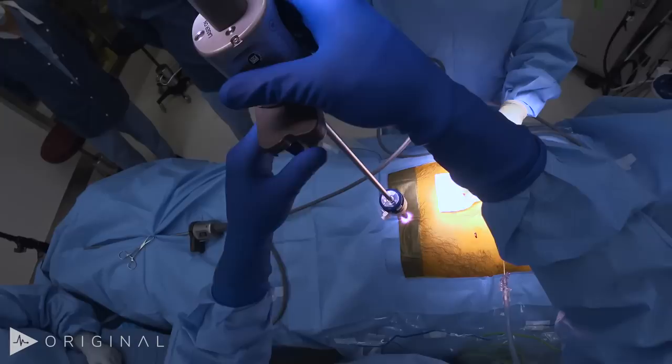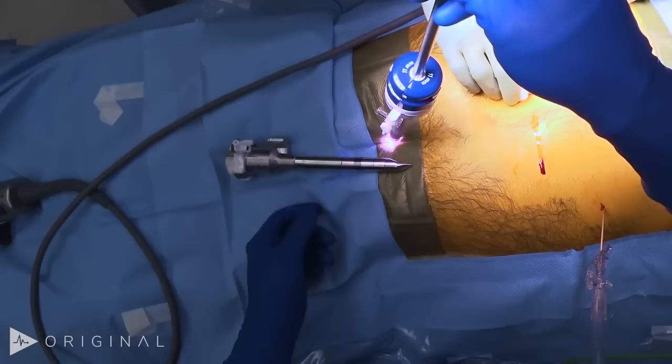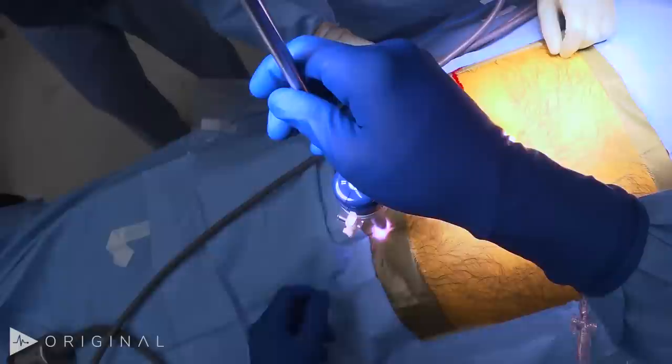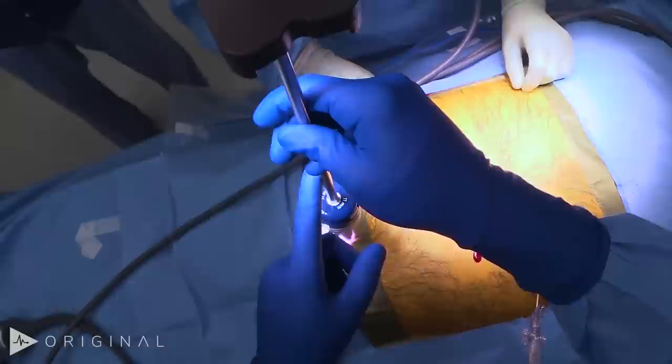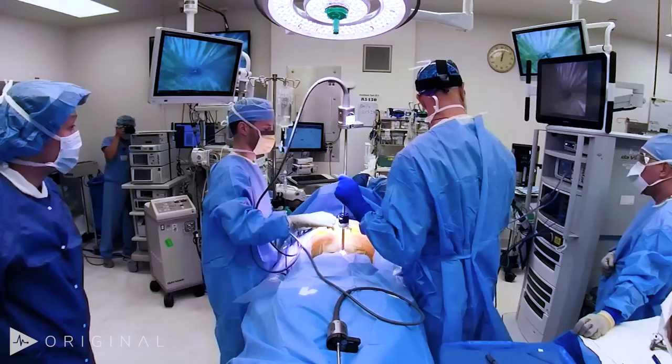One downside of the current Intuitive platform is they don't have an optical 12mm trocar anymore — they had one but discontinued it. The only 12mm they make now has a solid tip you can't put a scope through. So we open a Covidien 11mm optical port to get the first port in, guide it with the zeroscope, and then quickly replace both. The patient's heart rate went up briefly, end-tidal is stable, blood pressure hasn't moved, and we're up to 15 — so now we're ready to go in.